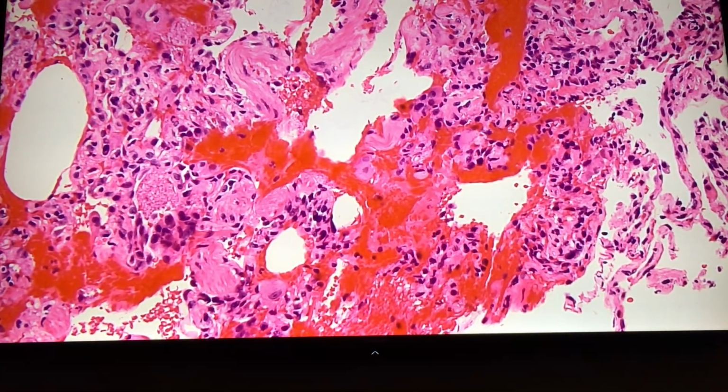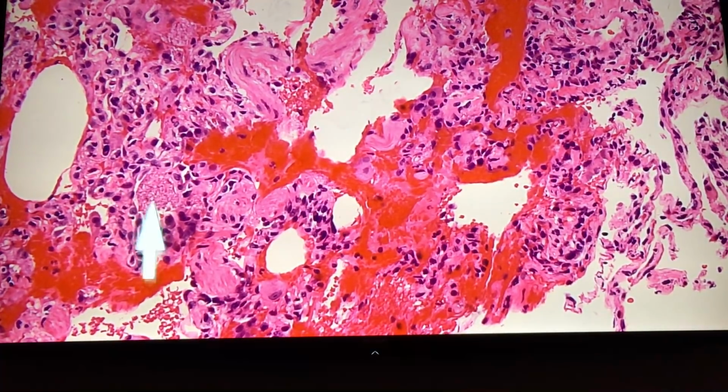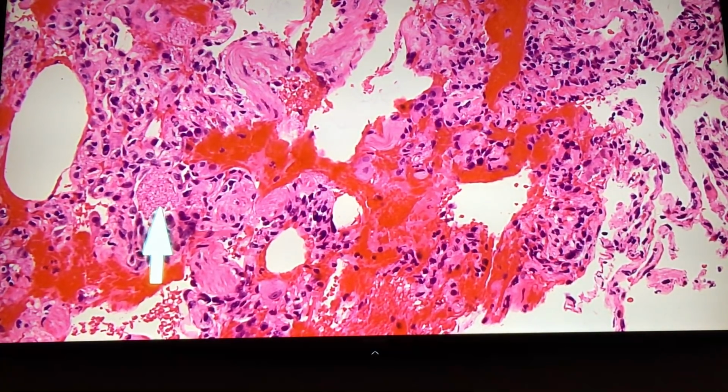And I'll tell you, there's a diagnostic finding in this field. PCP. Ooh, who said that? Oh, good job. Was that Aaron? Yeah. Do you see that? It is very easy to miss, because it's not like the lung is rip-roaringly inflamed or there's a frothy material.